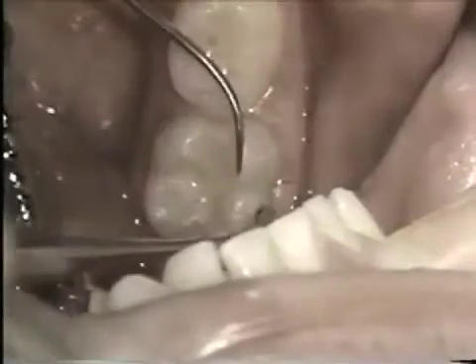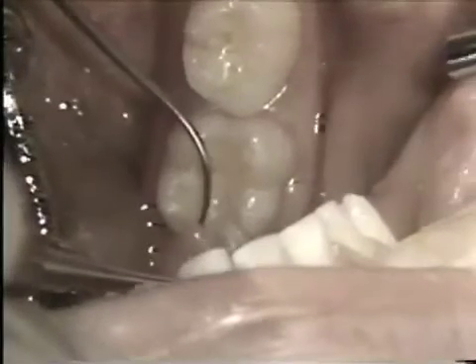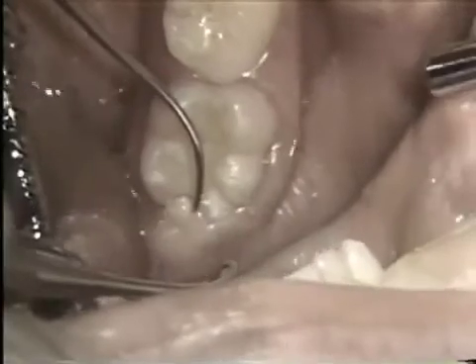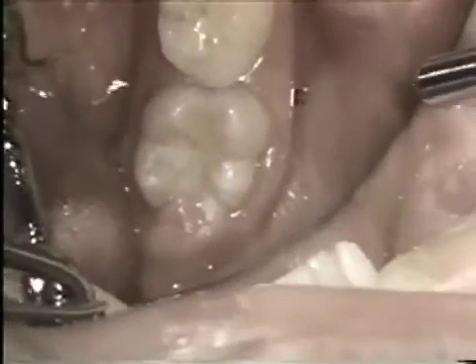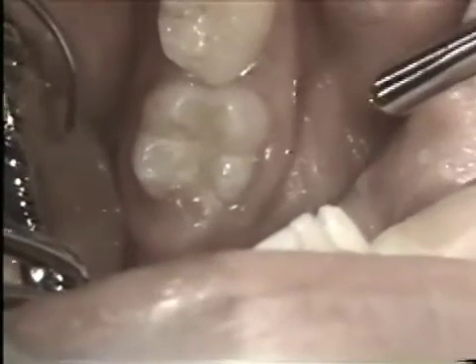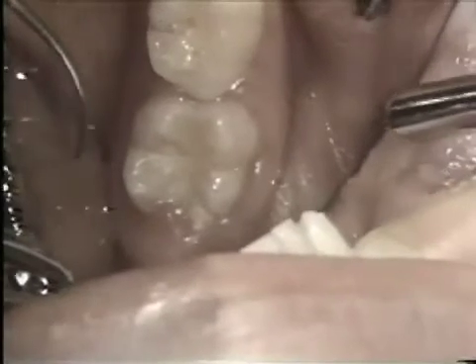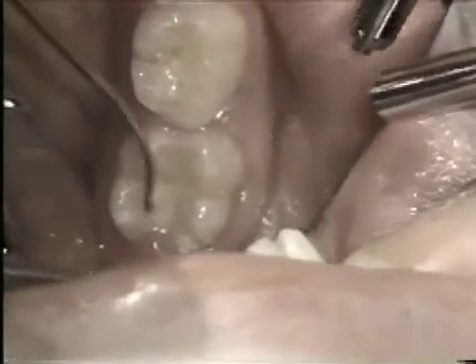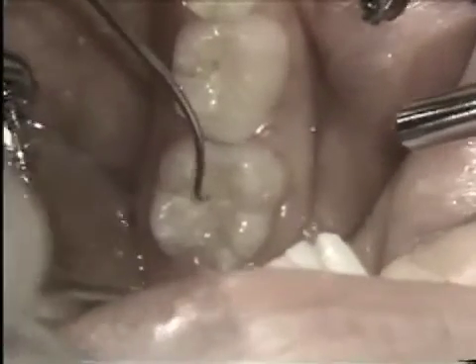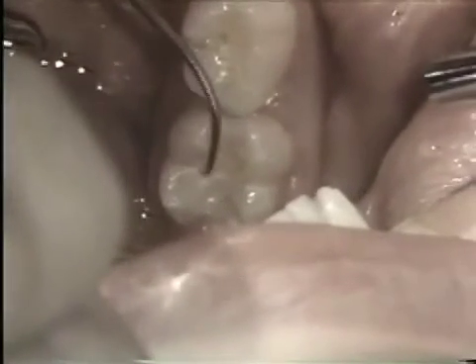Looking clinically into the mouth and evaluating the tooth surface, we want to isolate it to some extent and evaluate the tissue on the distal aspect of the marginal ridge. There is a small operculum of tissue, which puts the tooth into stage two of eruption and makes it a candidate for pit and fissure sealant. However, the prognosis is not the most promising without retreatment, and there is every likelihood this tooth may have to be retreated early in its sealant sequence to maintain integrity.